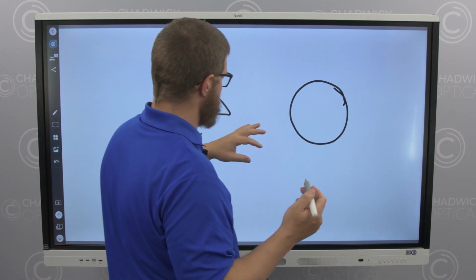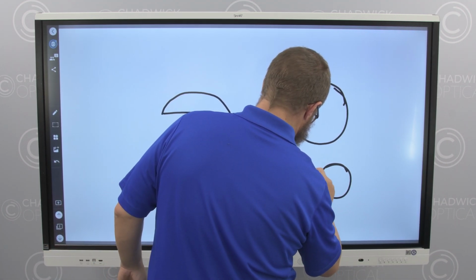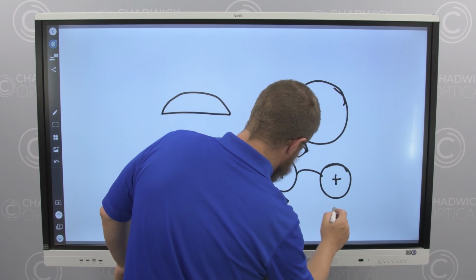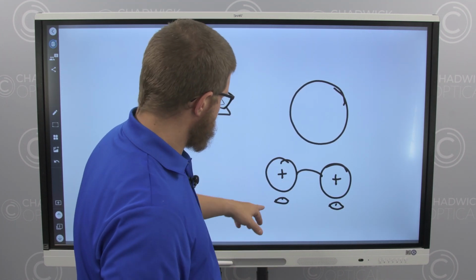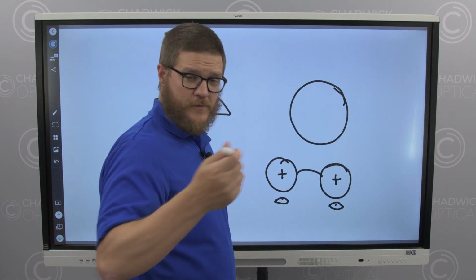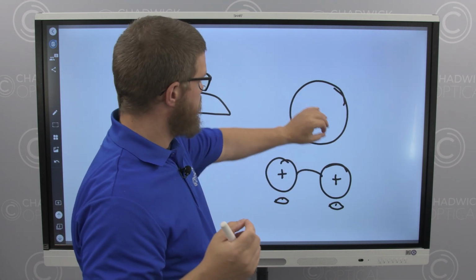Now, the way that you do that is you need the frame PD. The frame PD is the distance between your geometric centers. You can have the frame PD as close as possible to the patient PD. My art is suspect, I apologize. So if you have the frame PD equal to or very close to the patient PD, that allows you to center the lenses pretty much perfectly in the frame.